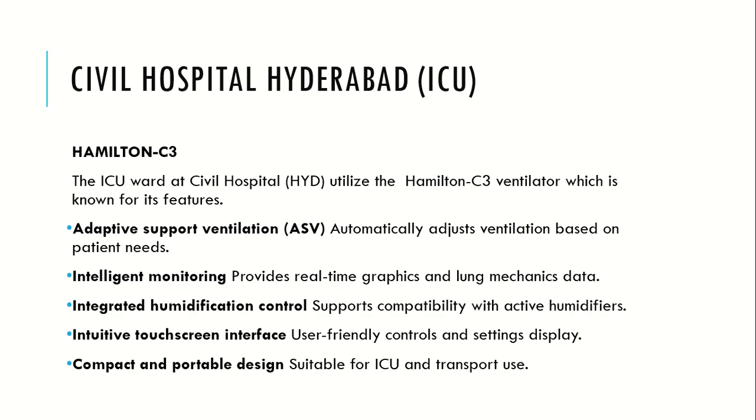I made a recent visit to several hospitals in Hyderabad and to the ICU ward. So I saw that they use the Hamilton C3 ventilator, which has the following features that allow easy use and interface with the operators. The adaptive support ventilation automatically adjusts ventilation based on the patient's needs, and the intelligent monitoring provides real-time graphics and lung mechanics data. Integrated humidification control supports compatibility with active humidifiers.